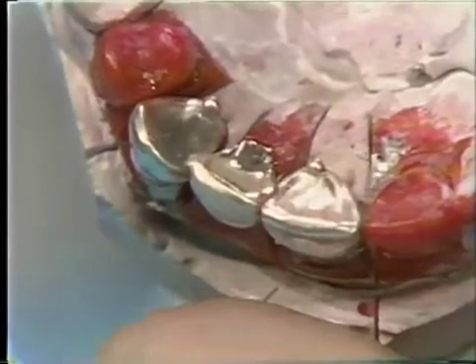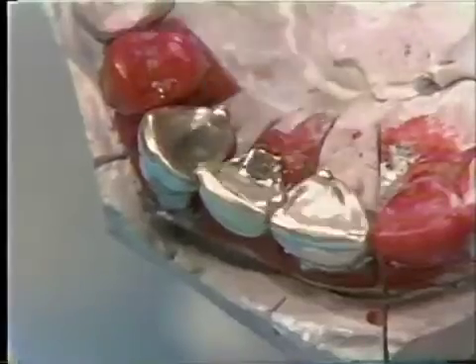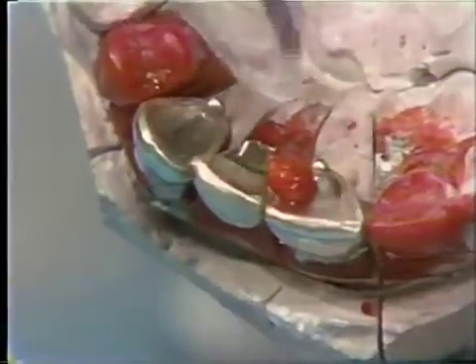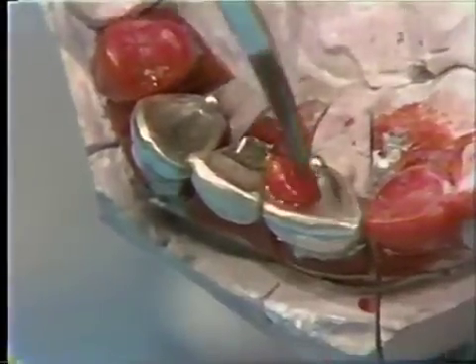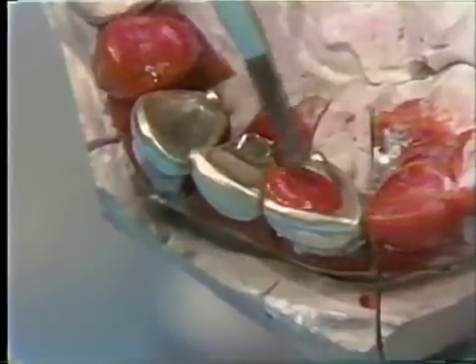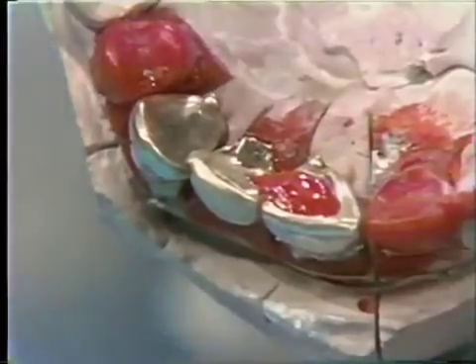We'll be adding Duralay to this lingual surface. The surface is wetted with the monomer and then small increments of Duralay are built up on the lingual surface, taking care to keep it away from the surface of the silver die and just keeping it contained on the gold casting.